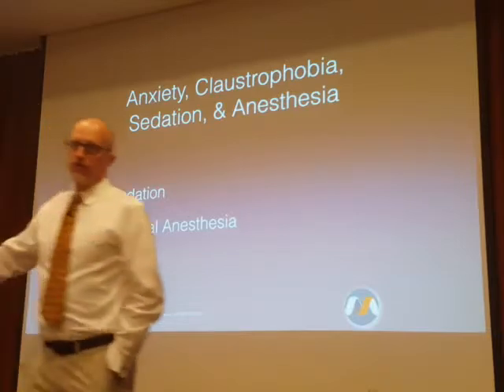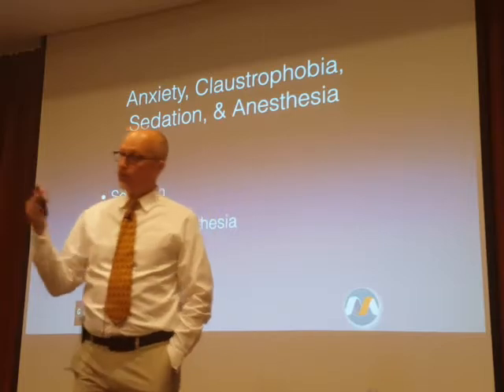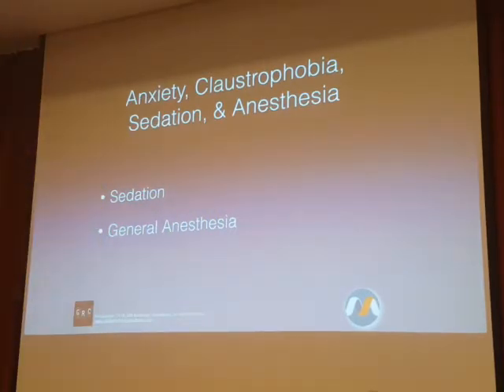I won't go into any detail about the direct risks to physiologic function and patient safety as a result of anesthesia. That's really the domain of the anesthesiologist. What I will say is that anesthesia and respiratory teams are one of the most infamous sources of MRI accidents and injuries that exists.